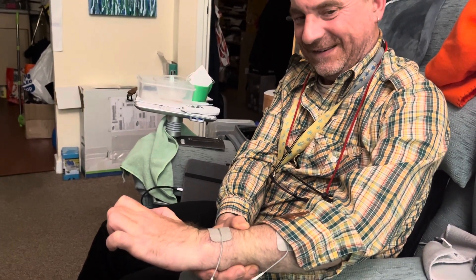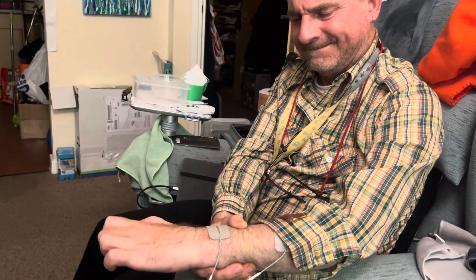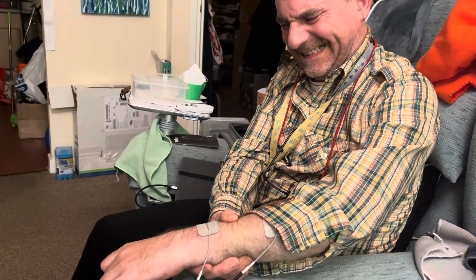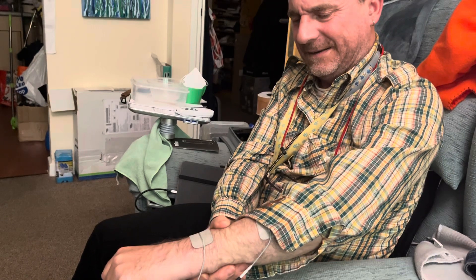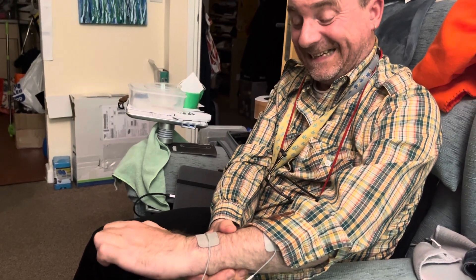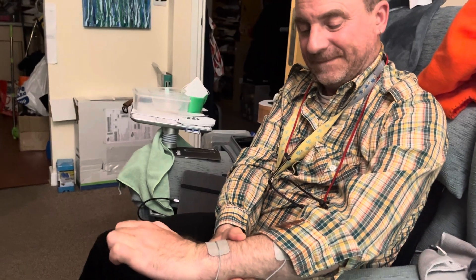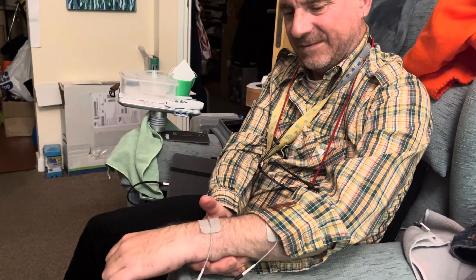Very strange, very very strange. There it goes, relaxing again. It's a very, very weird feeling, I can tell you. There it goes again. Can you put your fingers out? No, not really — I can't. I've got no choice. I can't possibly override the amount of stimulation being given by the machine.